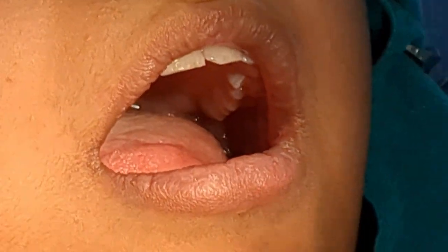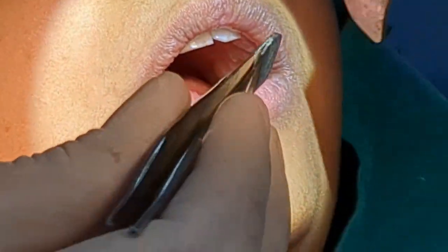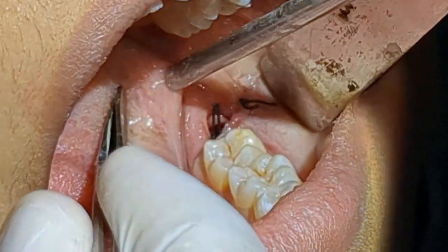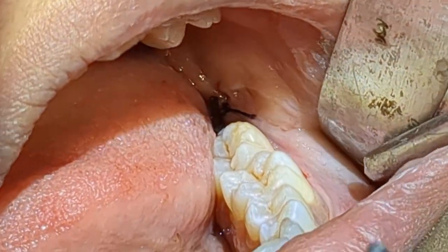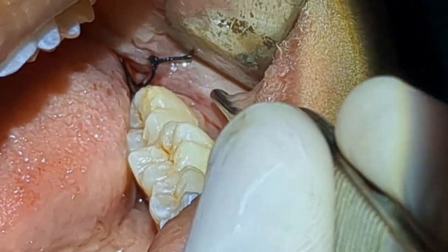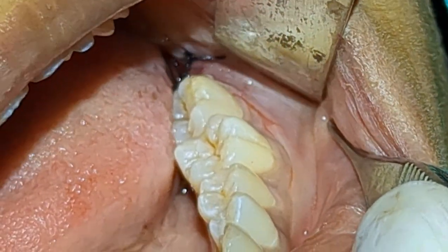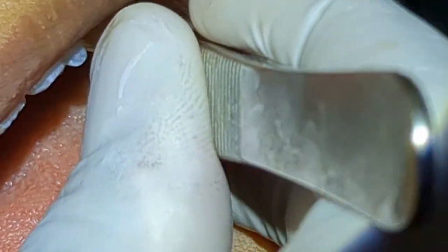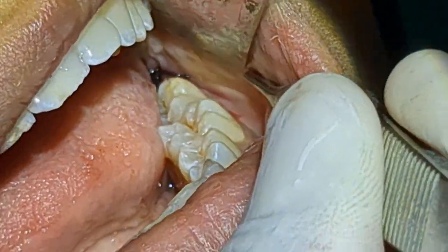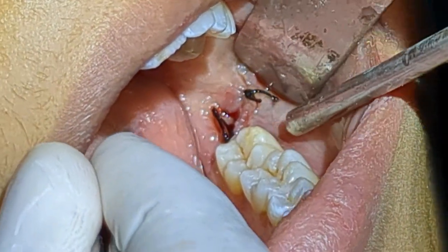Give me a tongue depressor. This is the closure. I am not going to give any suture at the releasing incision — the anterior releasing incision — because the patient is not going to pull this open. This is going to open only when we deliberately try to pull it open. Under normal circumstances this is closed, and with just the first suture it is going to heal just fine. There's no need to give a suture here. So only two sutures are given, and these are more than enough.